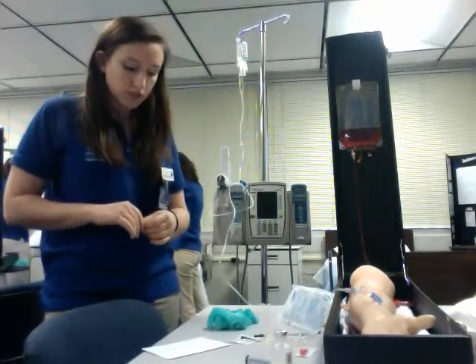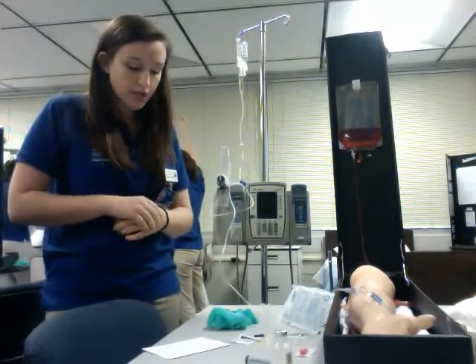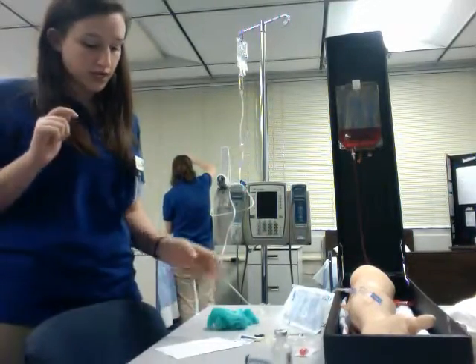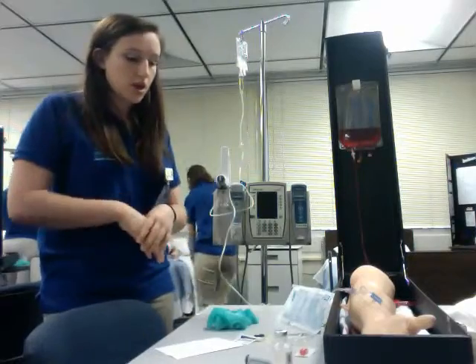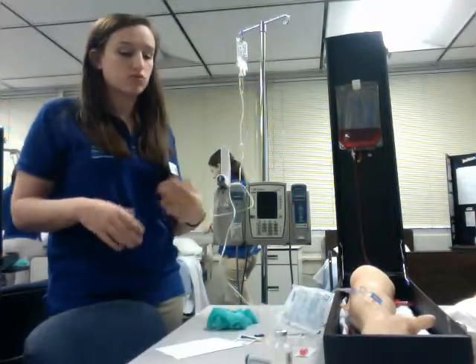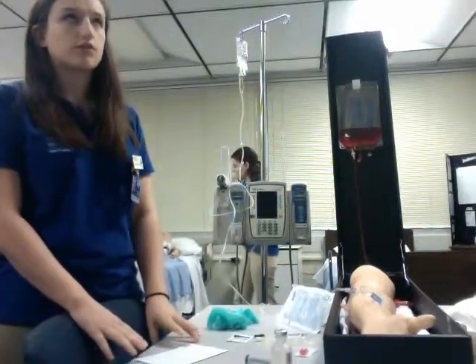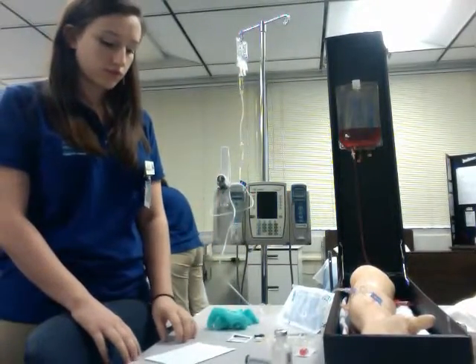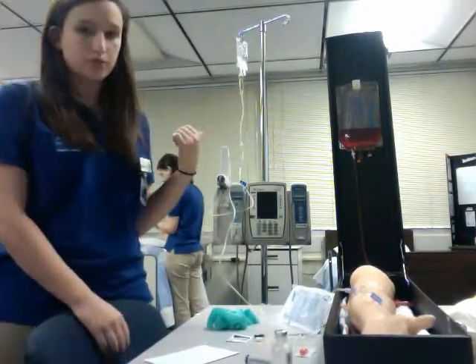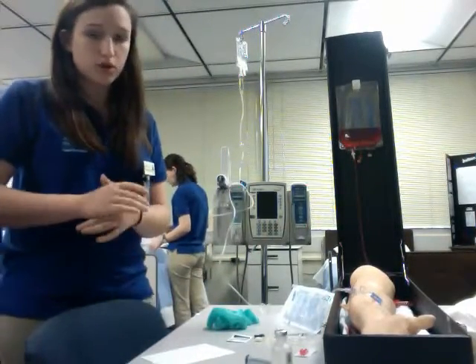The nursing implications would be to obtain specimens for the culture and sensitivity before initiating therapy, to monitor the I&Os, and assess the IV site for phlebitis, rash, and infiltration, among other things. I'm also going to check the labs, and I noticed that the patient has an elevated white blood cell count, which indicates an infection. So since the doctor ordered 500 milligrams of Flagyl, we're going to do 100 milliliters over an hour, and the drop rate for that would be 17 drops a minute.